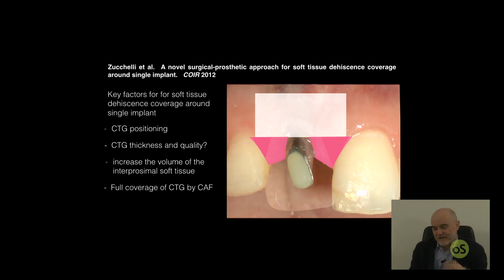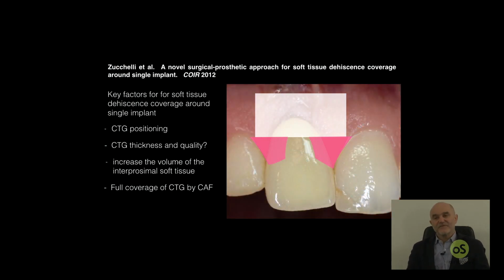the connective tissue graft. As you can see from this picture, if you try to make the same surgical procedure by leaving the implant-supported crown in position, more than 80% of the vascular bed you may have used surgically by working on the reduced abutment, with no crown, is occupied by the crown, which is completely avascular.